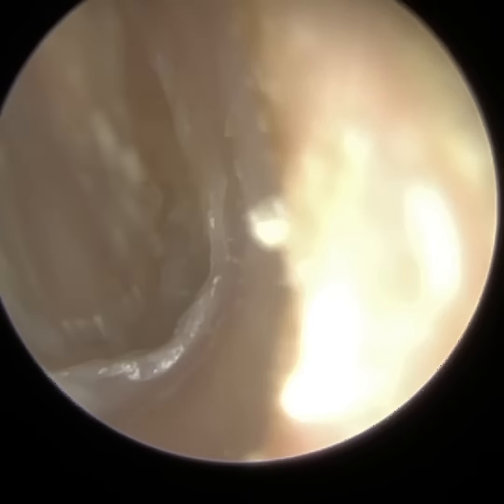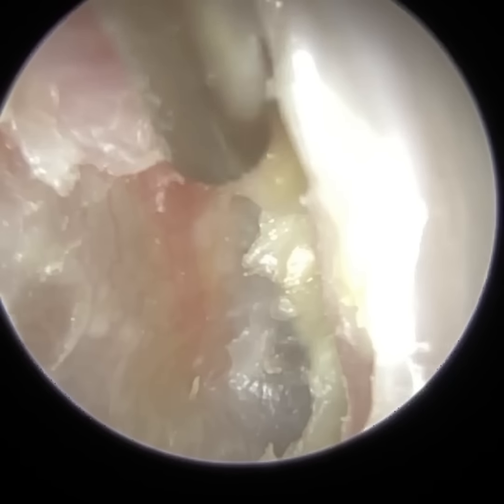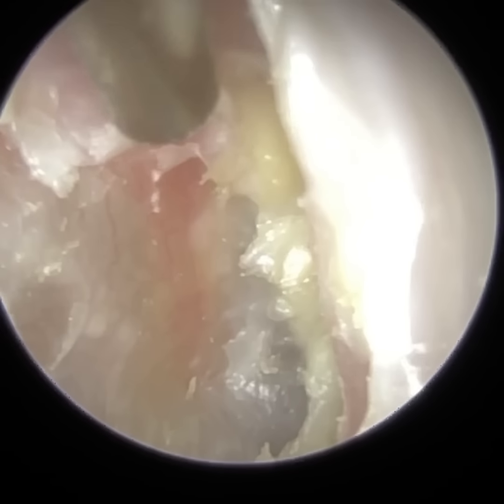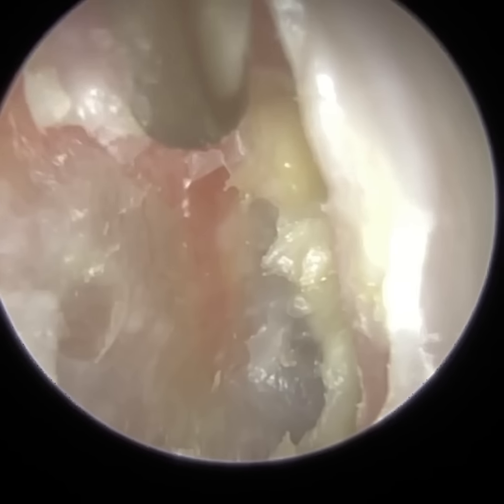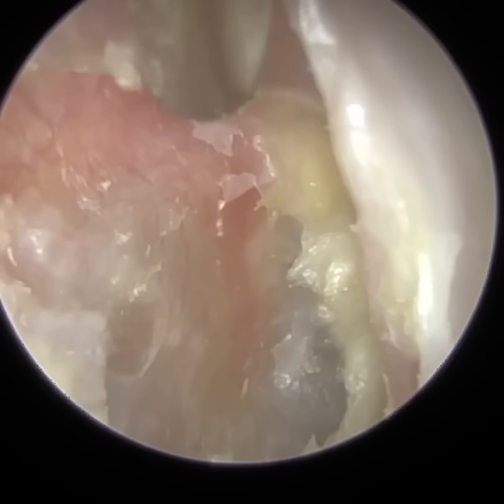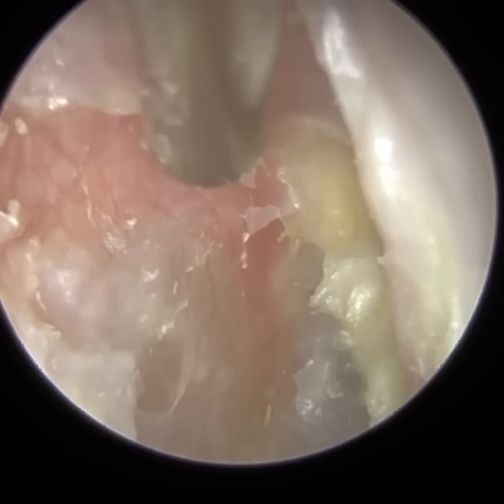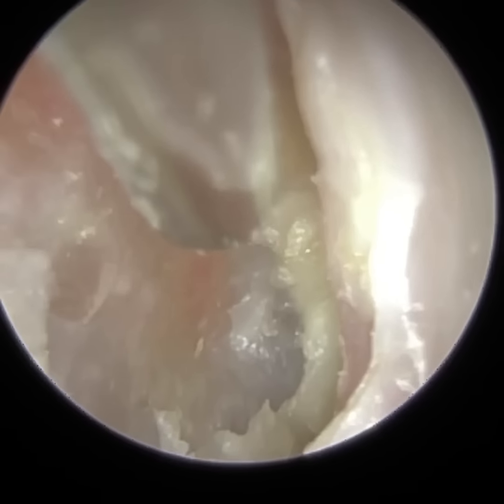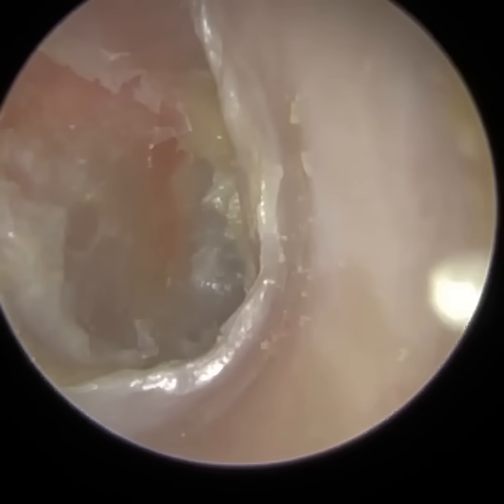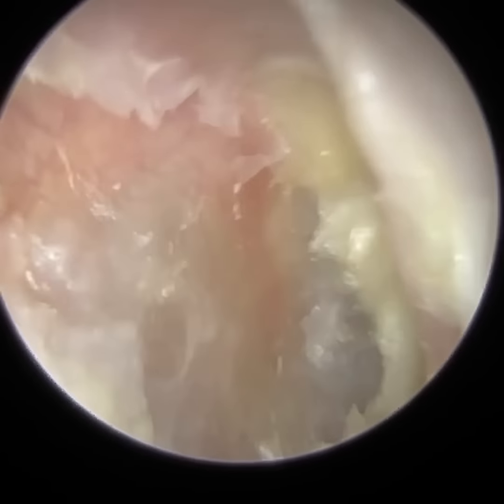The benefit of this luer lock mechanism is that it doesn't extend the length of the fine end when you're using it, so it's the same length as the normal suction probe. Also, it's much easier to attach. Attaching a fine end to the end of a Zollner can be a bit fiddly. Sometimes fine ends are loose, sometimes they're too tight. This overcomes that issue, and with the luer lock suction tips that I use, you can also rotate them.